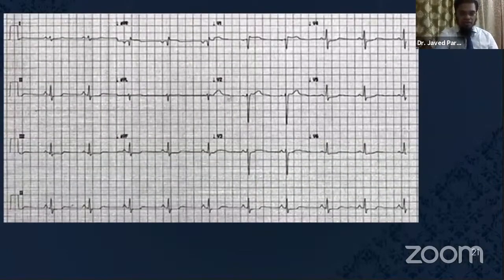Now have a look at this ECG. This is from a young patient who presented to us with multiple episodes of syncope, and you see the baseline ECG is almost normal. You have an rSR' pattern in V1. Other than that, there are no significant abnormalities, some ST segment flattening in 2, 3, aVF, nothing much.